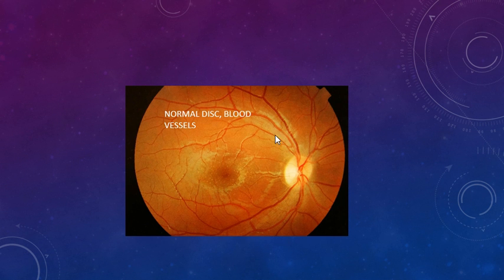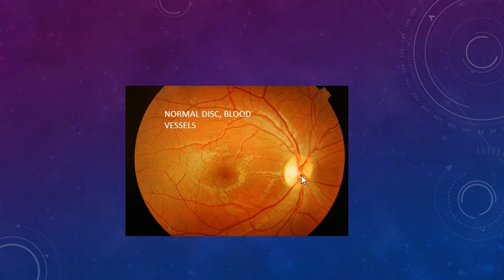This is the same image showing a normal optic disc and normal retinal blood vessels with some drusen in the macular area due to age-related macular degeneration. The vitreous here is clear — that is why we are able to see all the structures very clearly. Remember, this image is taken after dilation of the pupil with dilating drops such as tropicamide or cyclopentolate, with or without phenylephrine.